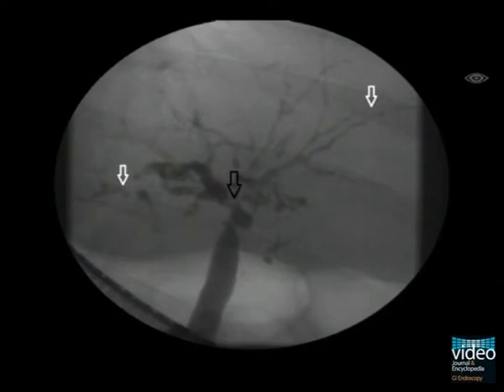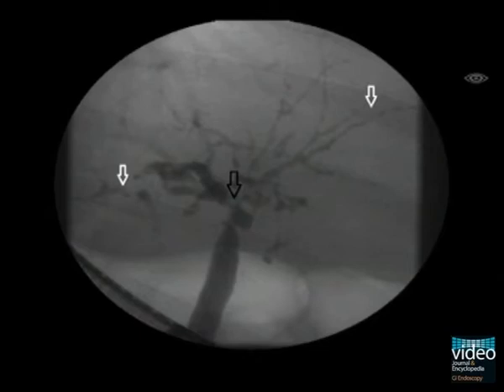To obtain a detailed look at the anatomy of the confluence, we have to rotate the fluoroscopy unit around the axis. Now we see a filiformis dominant stenosis of the left hepatic duct, indicated by the black arrow. The intrahepatic ducts show the classic appearance of PSC — we see rarefication of intrahepatic ducts with areas of beading with strictures and dilation, indicated by white arrows.